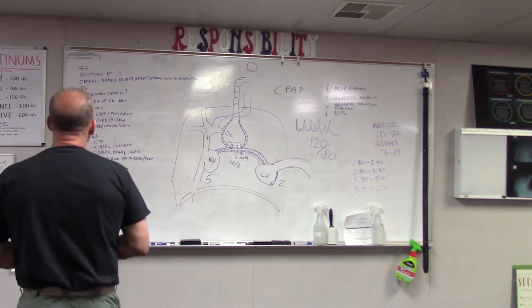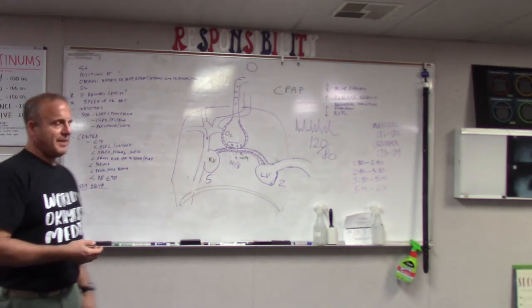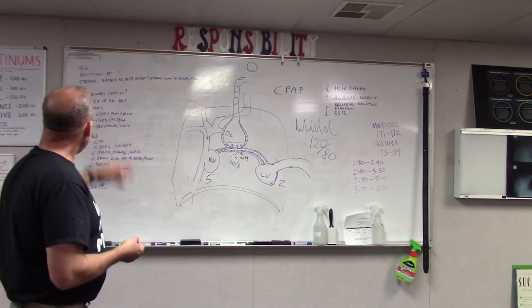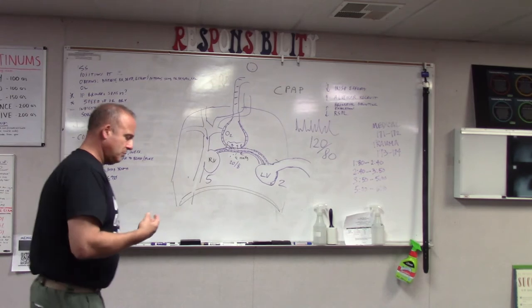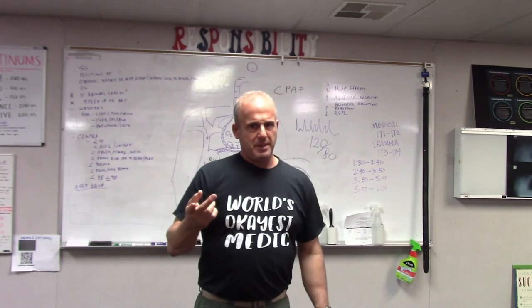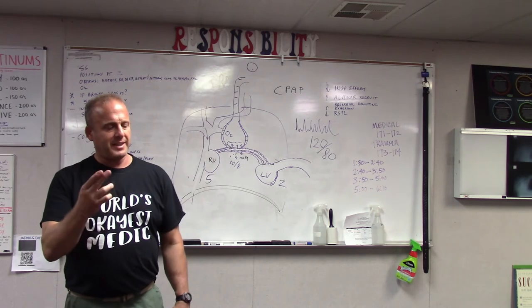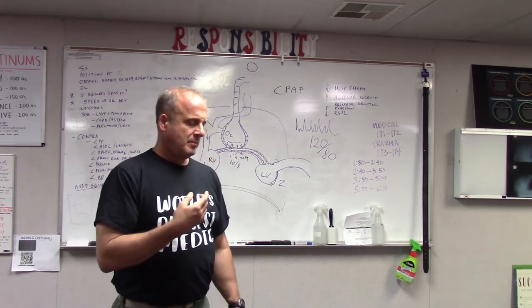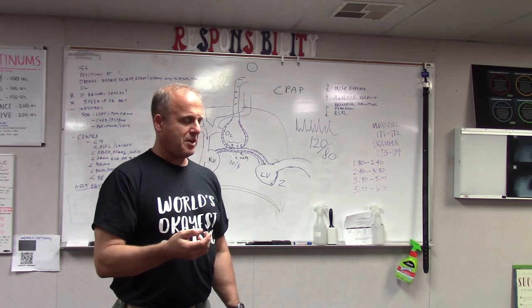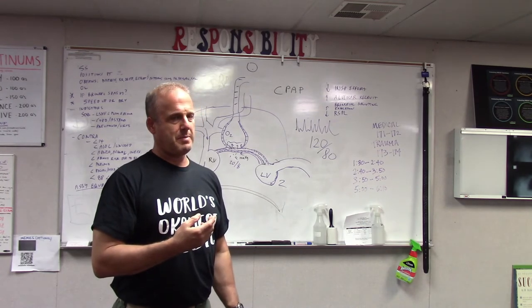So, coming down. When you have a person with trouble breathing, because that's why they call, or that's why you are called. The indications are pulmonary edema from left-sided failure, ideally, and not rate-dependent. Pneumonia, COPD, bronchitis, emphysema, bronchial pneumonia, asthma, and those are, at least in our county, the approved reasons for applying CPAP.